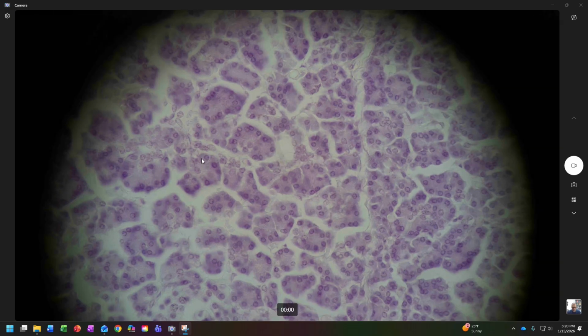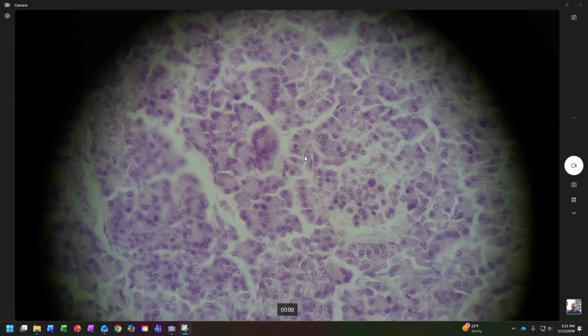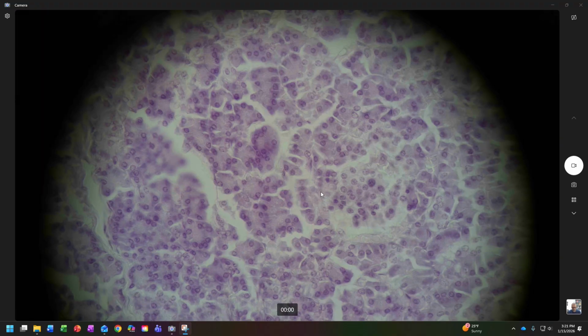Again, this is all acinar tissue. I don't know if those cells are, but sometimes you can't really depend on light and dark. Sometimes you have to look at just structure and imagine it in black and white. Here, I'm going to say this is an islet, I-S-L-E-T, because again, notice the structure of these. Some of this is getting destroyed from being cut, but these are definitely not looking like they were organized in any specific way. So that's an islet there. I'm not a fan of that image. We've got another one coming up. Let me go ahead and load it up.